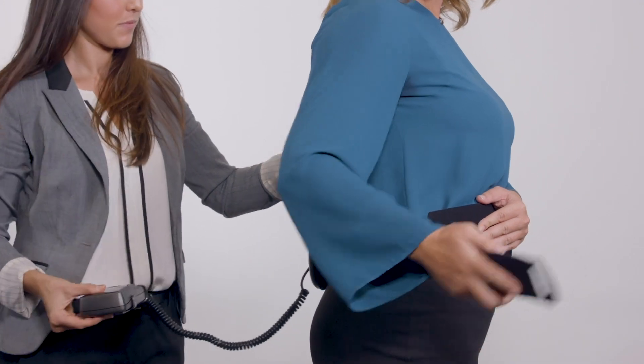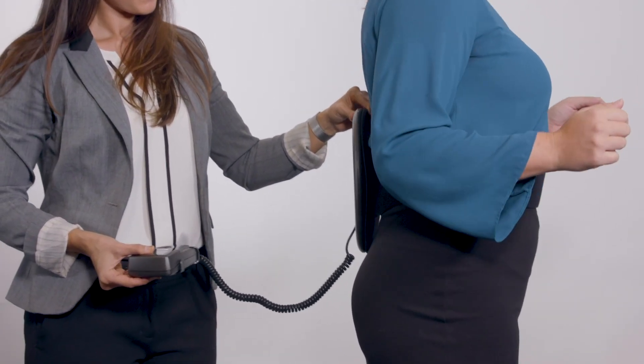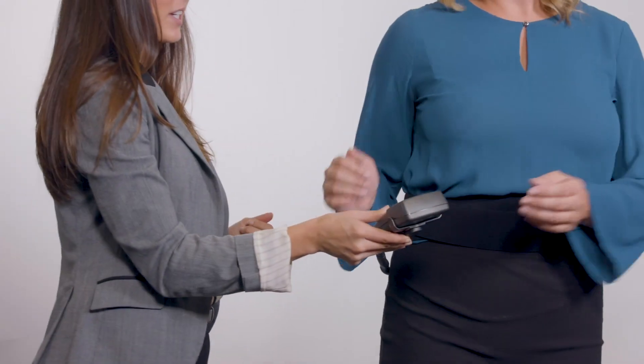The device may be worn over clothing or bracing. Ensure the control unit clips comfortably to the waist belt. You are now ready to operate your device.